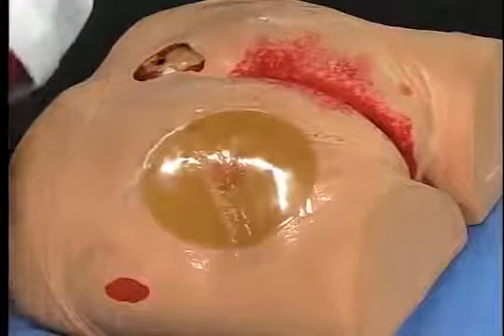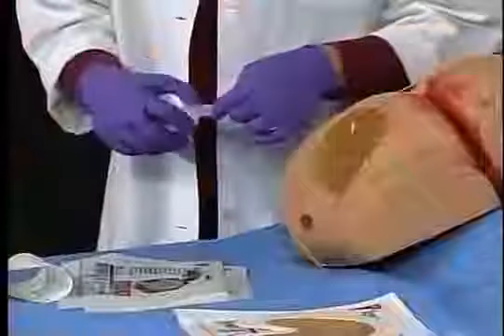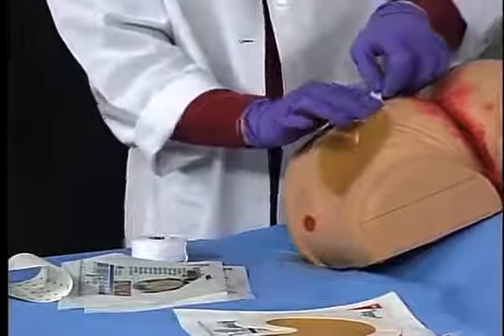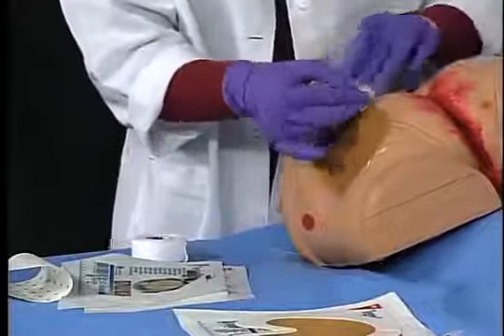If there is difficulty lifting the film border, you may apply a piece of tape to the edge and use that to assist you in lifting the edge.